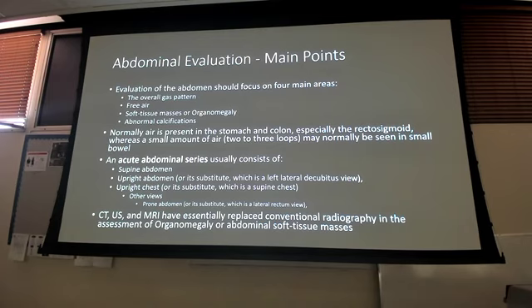So a PA chest. Why would I get a PA chest? What am I looking for in a chest x-ray? Air where? Under the diaphragm, right? I want two views of that diaphragm, depending on how well they did that upright abdomen. Now, on the upright abdomen, I might get that air under the diaphragm too. But if I combine it with that chest x-ray, I can guarantee I'm going to be able to see that and make that evaluation, right?